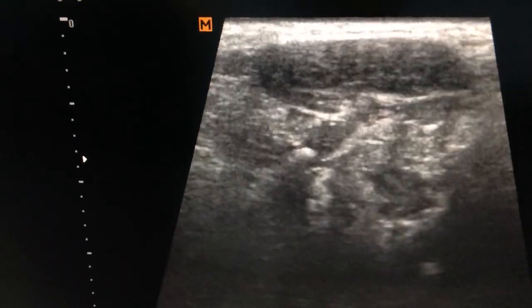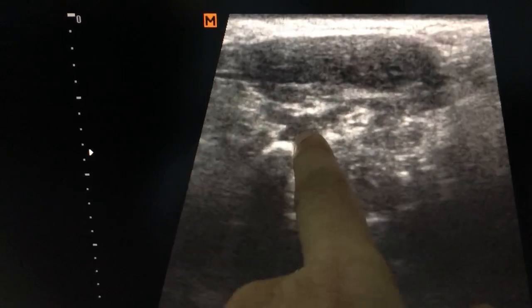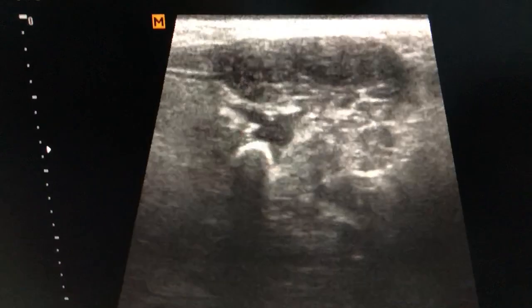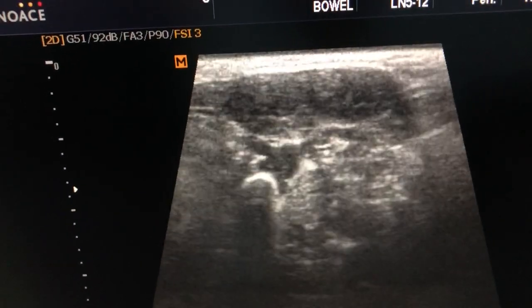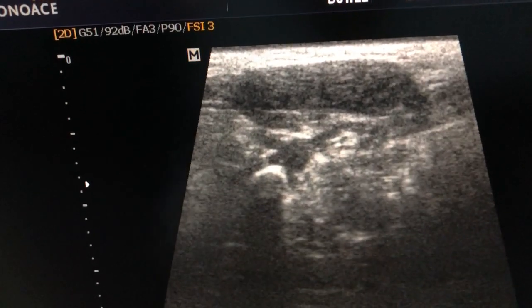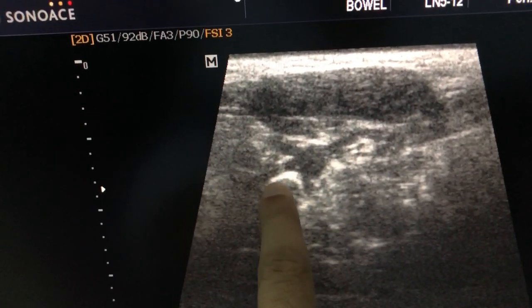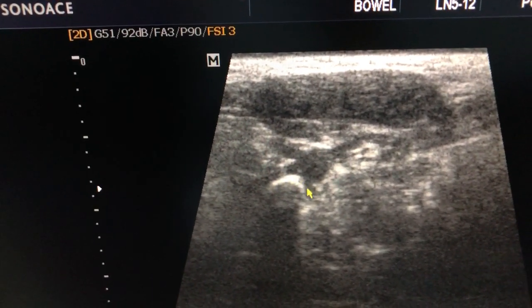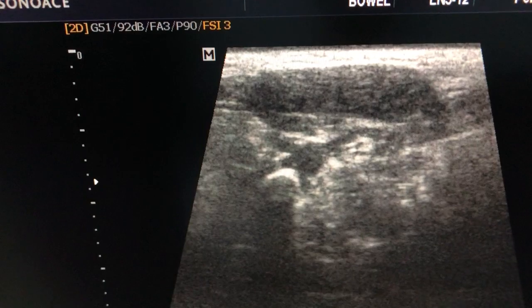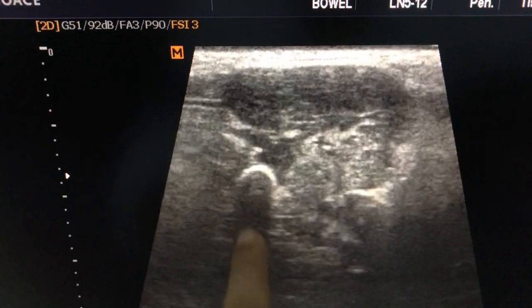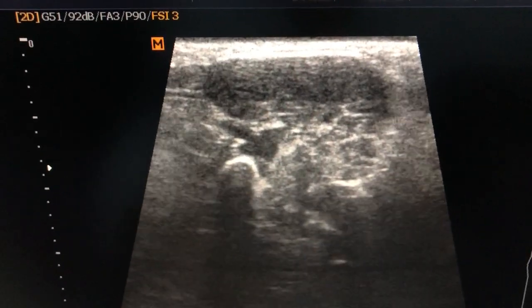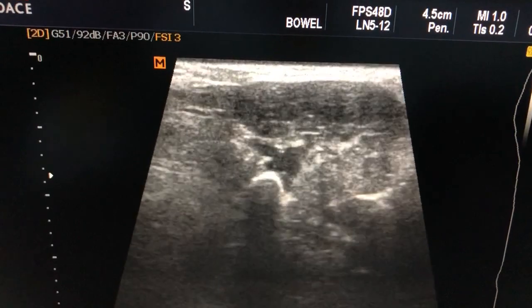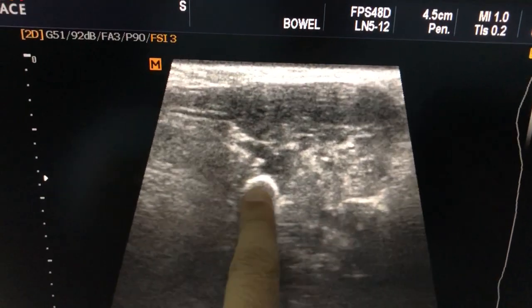If you see it carefully, this duct is going towards the submandibular gland. This is the duct coming out from the submandibular gland, and here you can see carefully — this is the calculus in the duct. This hyperechoic area is the calculus in the duct. It is also showing a posterior acoustic shadow, just like a calculus in the kidney.